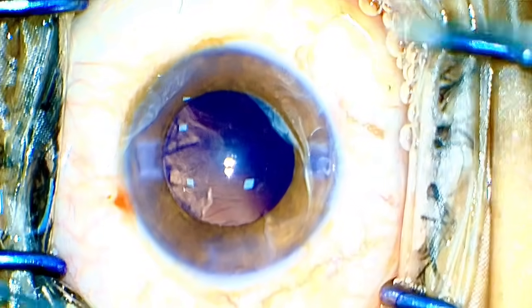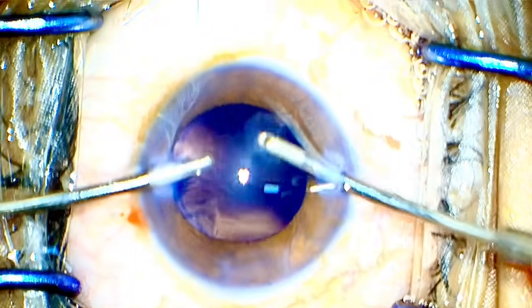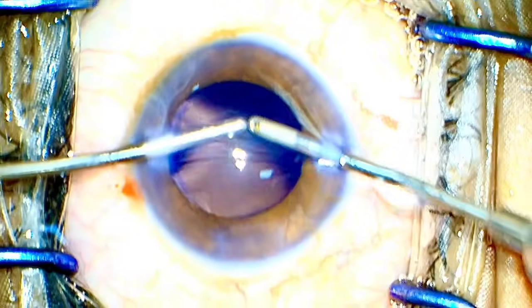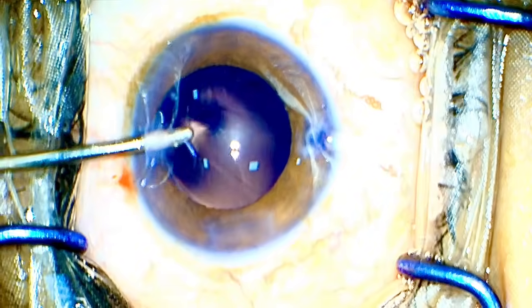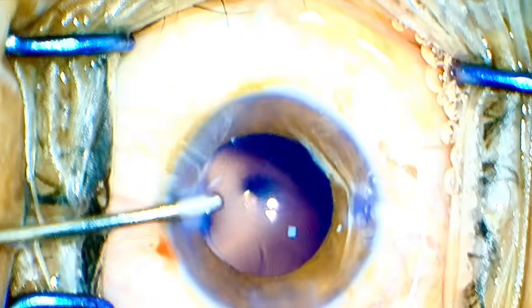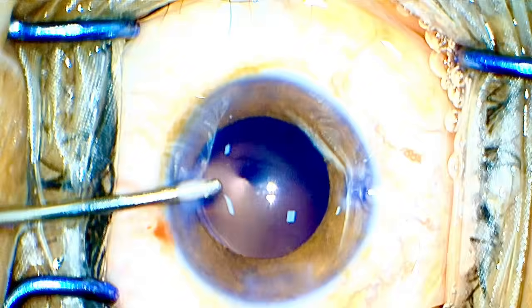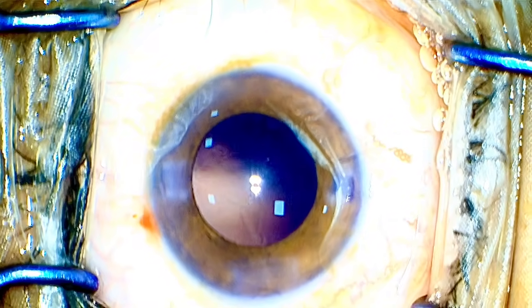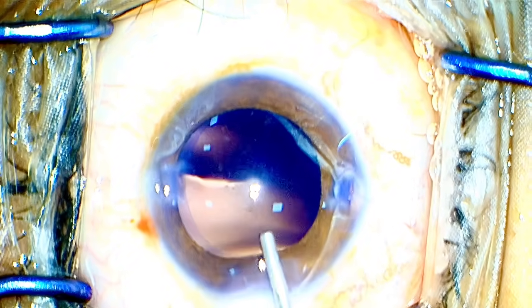So as the diabetic cases in your career in India, in US and all across the globe increase, we as cataract surgeons must know alternate techniques of operating a cataract case. A good surgeon, a versatile surgeon, is the one who can switch his techniques according to a case. If it's pseudoexfoliation syndrome, you should know the go-to technique. If it's a zonular dehiscence case, you should know the go-to technique. If it's a small pupil case, you should know the go-to technique. If it's a diabetic cataract, the technique changes. If it's age-related cataract, the technique changes. If it's brown, hard cataract, Niagara case, the technique changes.